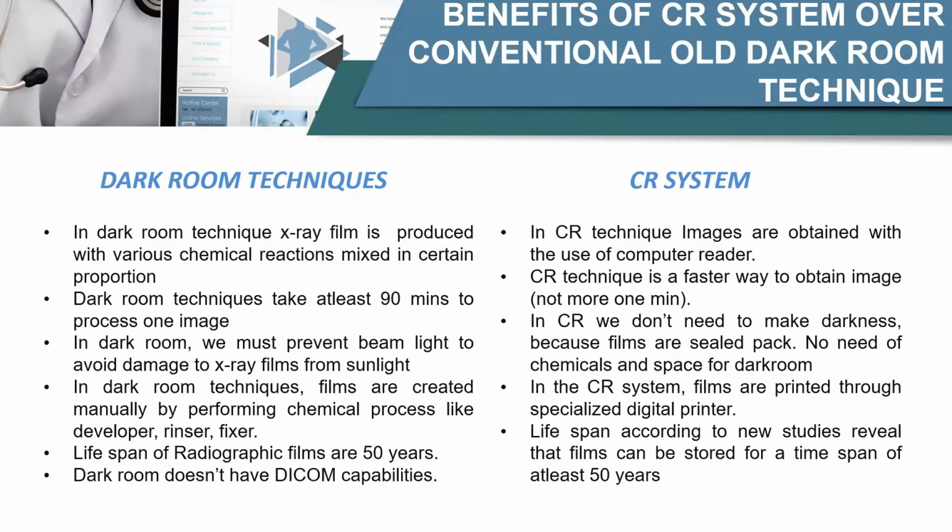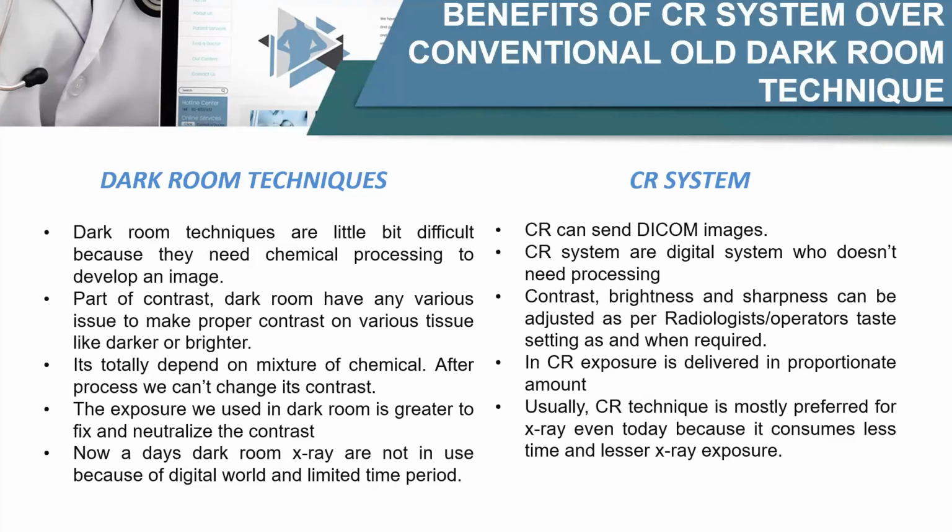Next slide, please. In the darkroom technique, it is a bit difficult for technicians to develop image because there is chemical processing. The chemicals are harmful actually for the skin or for the respiratory system. Here we don't use any chemicals in CR system, so it is quite comfortable to use. Part of contrast, in the darkroom it varies actually.